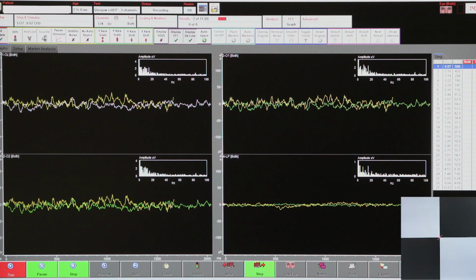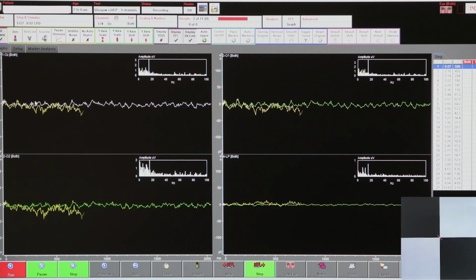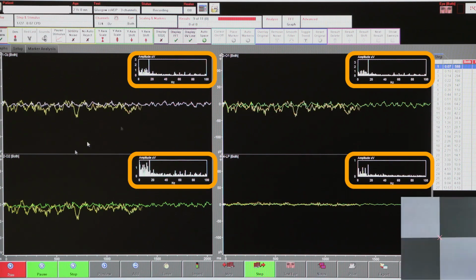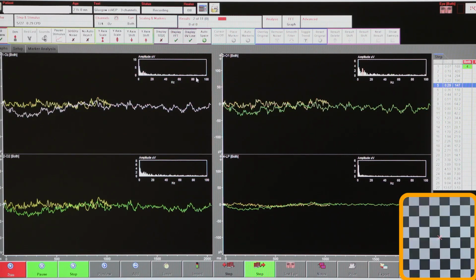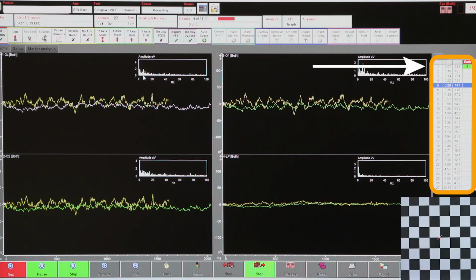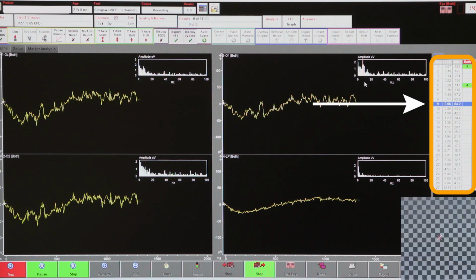So let's start our recording now. You can see the 4 channels of ongoing EEG data. An inset in each of these time-based windows is a frequency-based plot. We're looking for a significant VEP at the stimulation frequency. A VEP was found there, and you can see that the stimulus has changed to a smaller check size, and in the results table we have a green detection against that last check size, and we've dropped 4 steps, and we're now trying the check sizes indicated by the blue band.